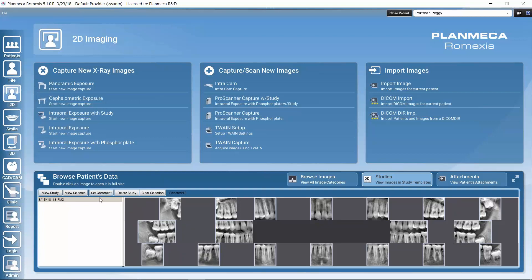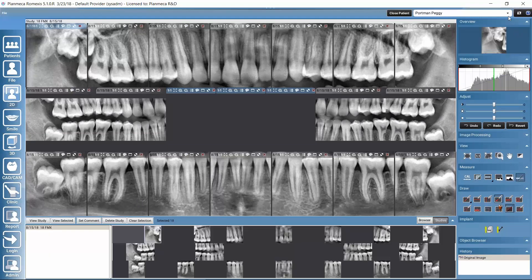'View Study' always opens the whole study. We could also add a comment for the study, delete the study, or clear the selection of images. Let's click on 'View Study' to open the whole study. All of these images get opened, in the order in which we defined them when building the study or when capturing images. These images have similar controls as any 2D images.